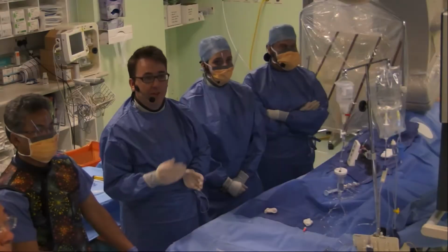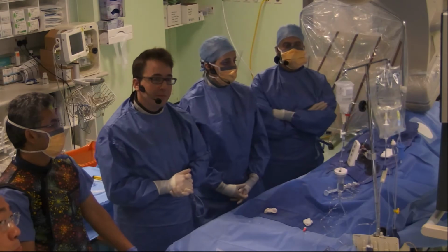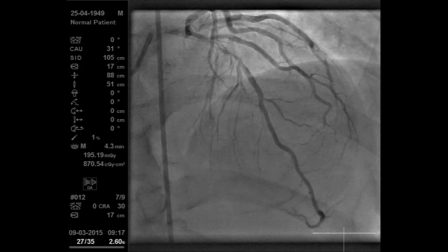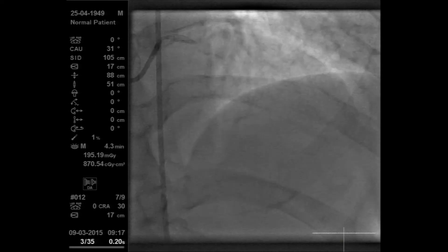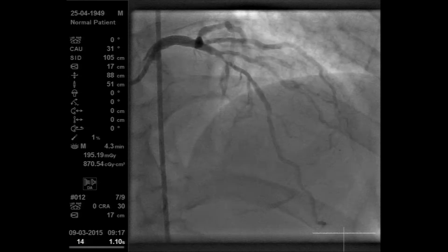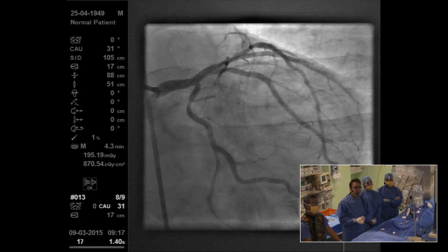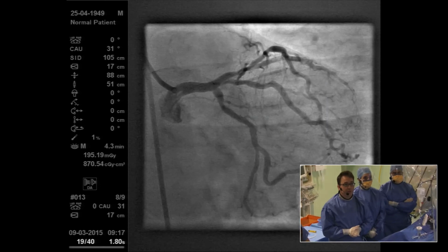So now we've got the left system, and let's have a look at the angiogram pictures from today for the left system. And you can see, as was the case before in the diagnostic pictures, there's disease in the LAD, and you can see there's one more focal area. Then there's another area just after that which is more moderate. Then there's a more intermediate area more distally, just as that bifurcation of a second or third diagonal comes off. And let's flick ahead. You can see on the other views much the same. There's a pinching of the proximal circumflex artery here as well.